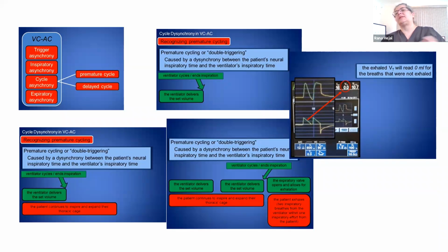At the bedside you see a patient that's not moving at all, not having any effort. And when that happens, the solution is trying to readjust sedation. Some sedatives are more prone to this than others, but it is patient dependent. So you have to play around with sedation, and sometimes you have to liberate them from sedation and tolerate a period of time of something like this that's a bit on the dangerous side before you optimize their ventilator strategy.